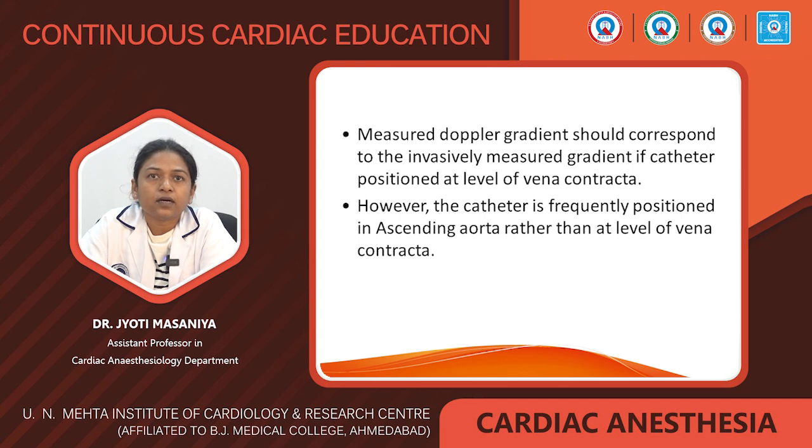The measured Doppler gradient can correspond to the invasively measured gradient if the catheter is positioned at the level of the vena contracta or effective orifice area. However, the catheter is frequently positioned in the ascending aorta rather than at the level of the vena contracta.